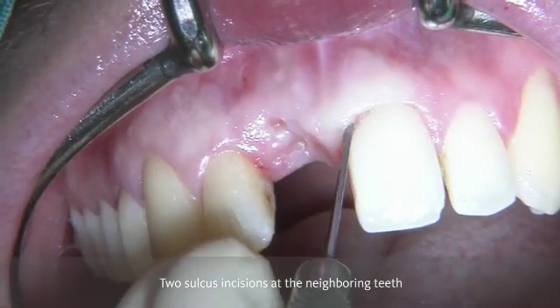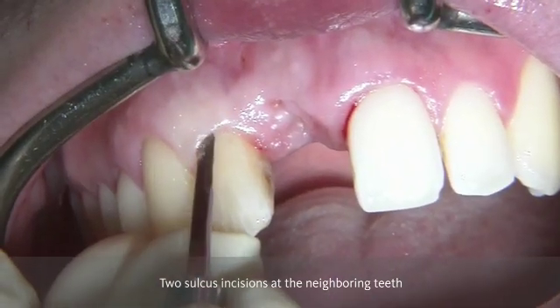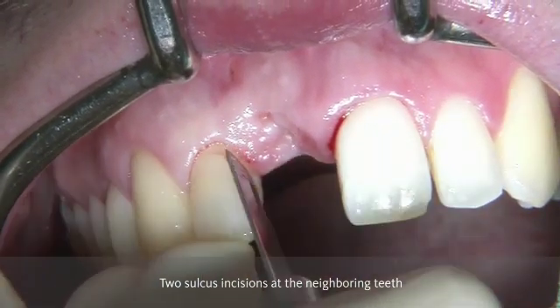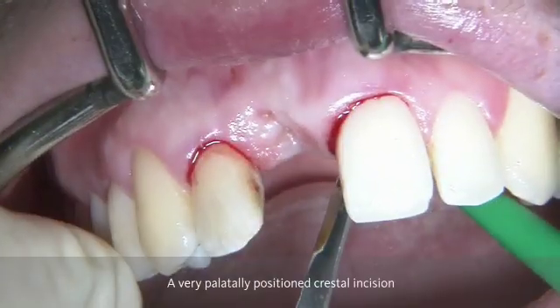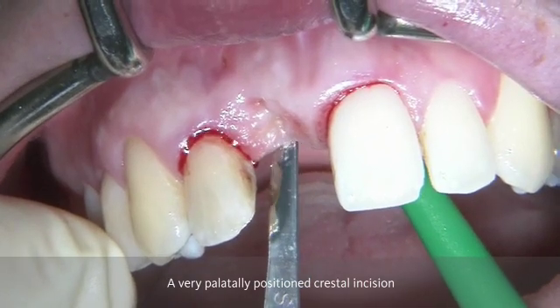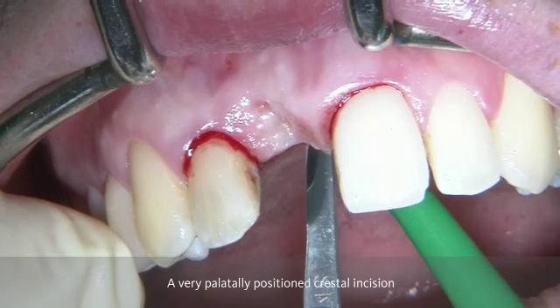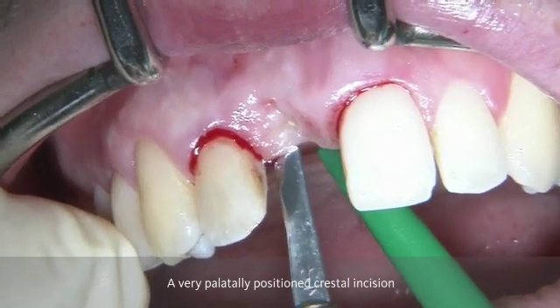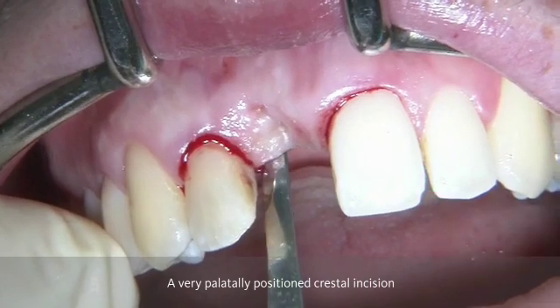In order to access the area of regeneration, we are going to do two sulcular incisions at the neighboring teeth with a micro blade and a very palatally positioned crestal incision. In order to be able to do a GBR procedure on the buccal aspect, it is mandatory to have a vertical releasing incision.